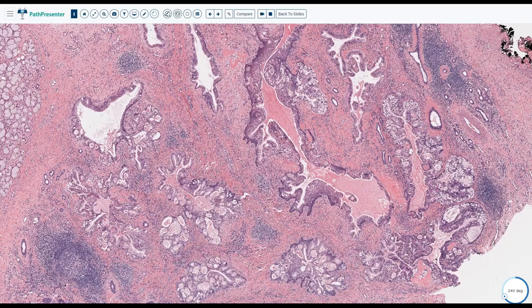Do you think immunostains can help with these lesions that you're not happy with or cannot really get into? Well, with the squamous component, sometimes you are dealing with squamous mucosa. So usually you don't think canalicular adenoma, but anyhow, there will be some fragments of squamoid cells, especially in a fragmented mucocele, as lip biopsies are usually fragmented.